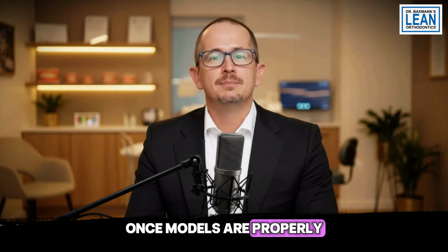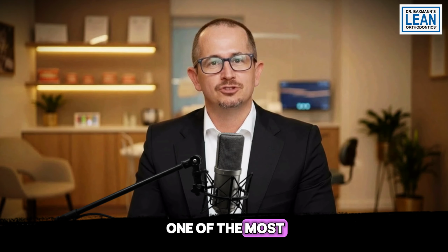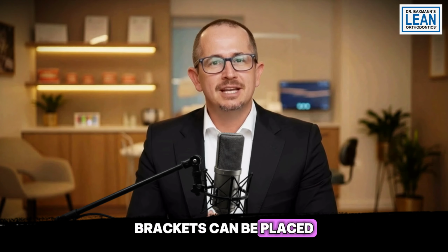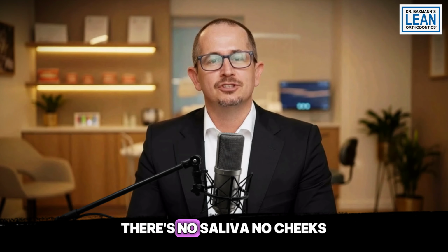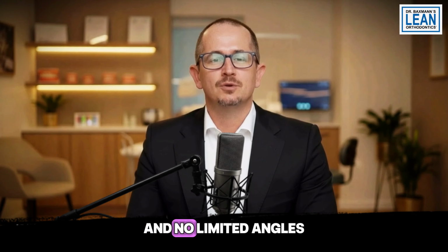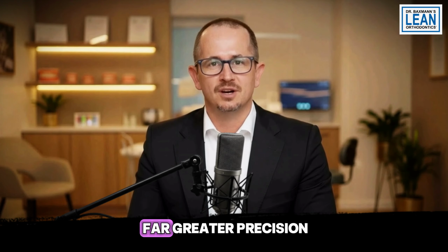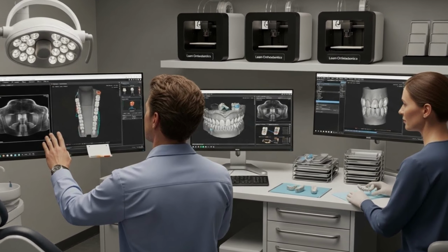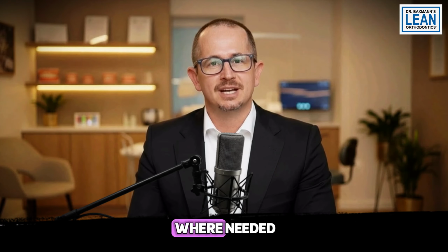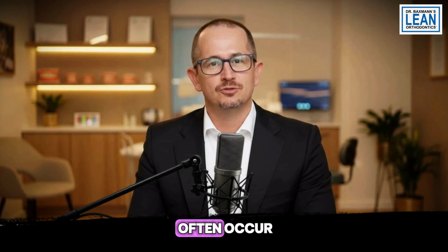Once models are properly mounted and verified, digital indirect bonding becomes one of the most powerful applications. Brackets can be placed virtually with full visibility, even in posterior regions where clinical bonding is most difficult. There's no saliva, no cheeks, and no limited angles. You can rotate the model freely and position brackets with far greater precision. Bracket heights can be preset based on tooth anatomy and prescription, then fine-tuned manually where needed. The result is increased accuracy, especially where errors most often occur.